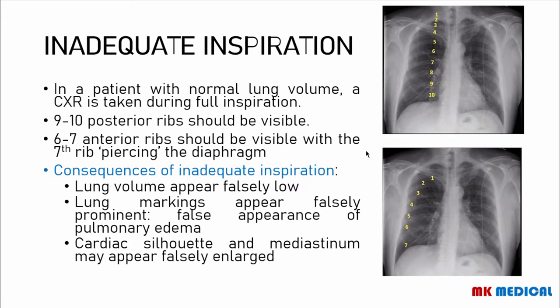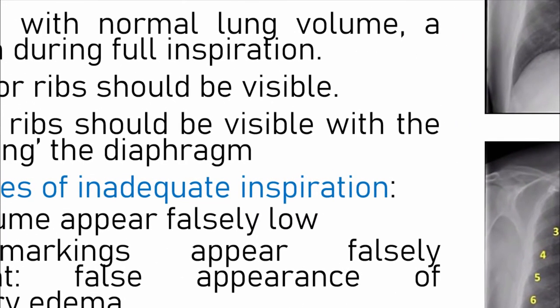And if we take an x-ray with inadequate inspiration, it means that the lungs are going to be appearing much smaller than they are supposed to be. Some lung markings may be falsely prominent, so you may have a false appearance of pulmonary edema. The cardiac silhouette and the mediastinum are going to be appearing much larger than they're supposed to be. So let me just zoom this here on your right so that you can see exactly what I'm talking about.